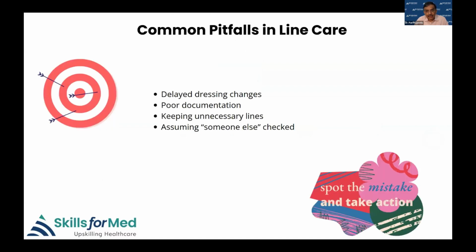So, common pitfalls. Various studies have pointed out that these are the 4 common pitfalls in line care. One is you delay the dressing changes. You would have noticed it is a little bit soiled, you say, okay, let's change it the next shift. Don't do that. Change it properly. Poor documentation. Many times, even though things were done, they were not documented. So we don't know whether it is done or not.